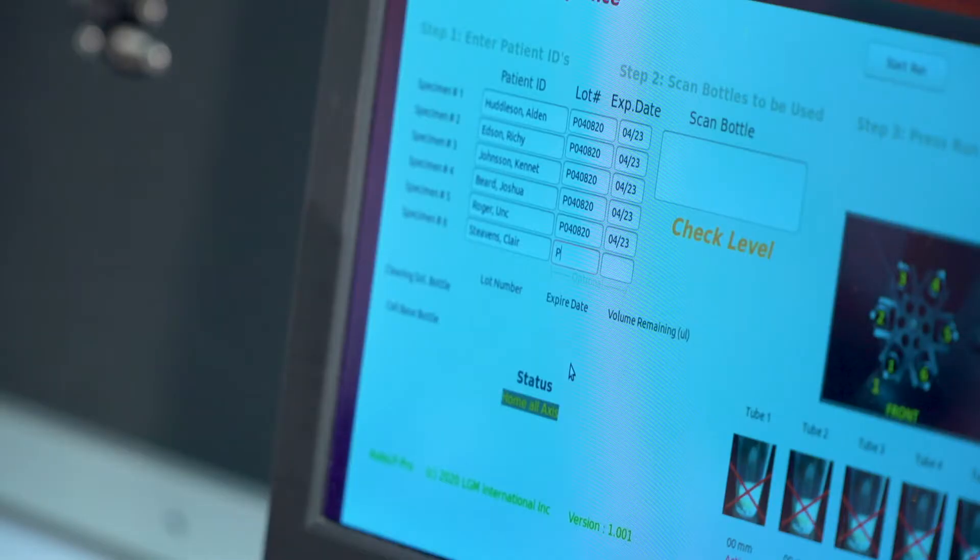Enter the patient identification into the AutoLP Pro database. You may also enter the vial lot number and expiration date for full processing control.